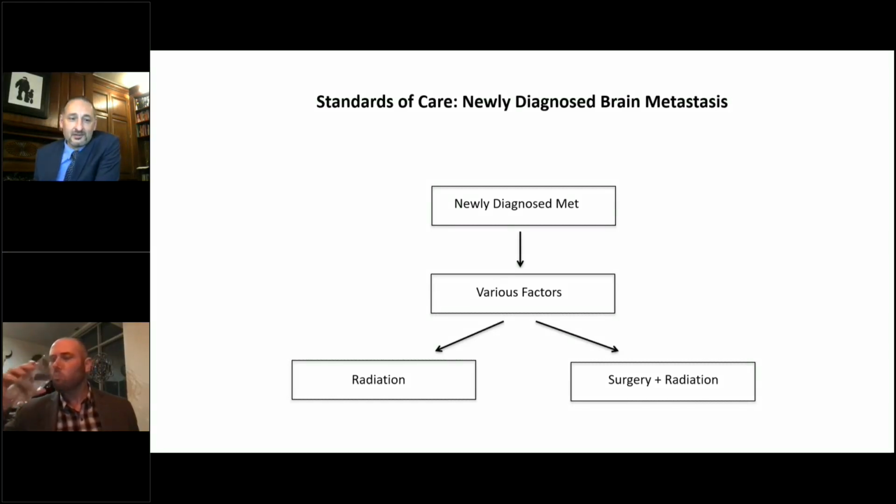In this particular case, we felt the easiest way to get to it was transcerebellar through the middle cerebellar peduncle. The one thing I would say is, before you run guns blazing into the pons, I would recommend getting some experience with the technology first. That would still scare me a little bit now, but people have to push the envelope for us to learn what we can do. I've been a bit more conservative, but I am starting to push that envelope more, and learn with more comfort with the technology what can be done safely.